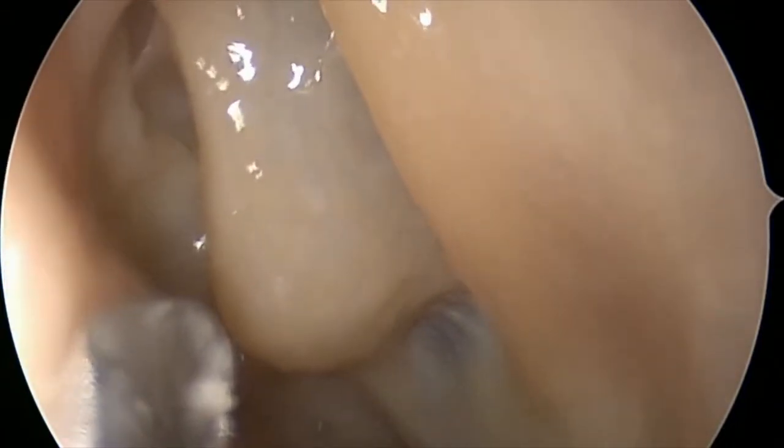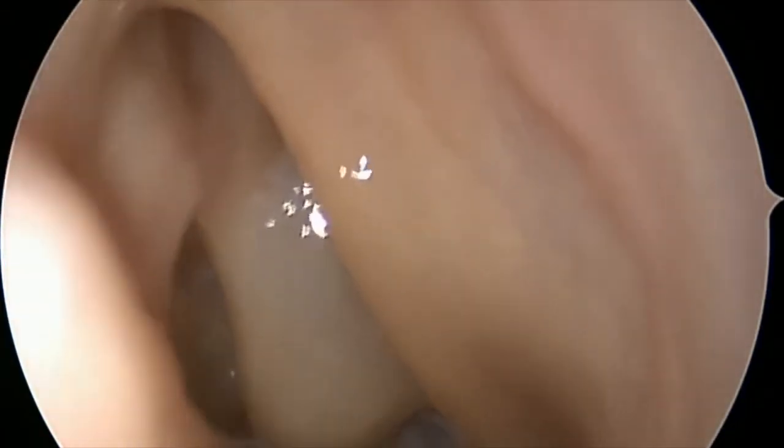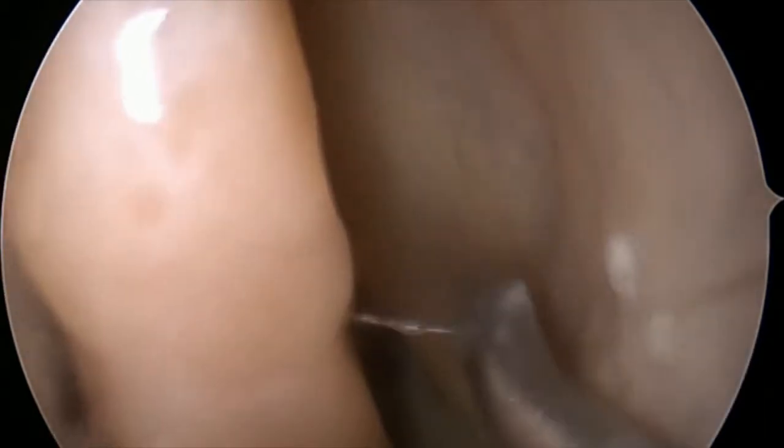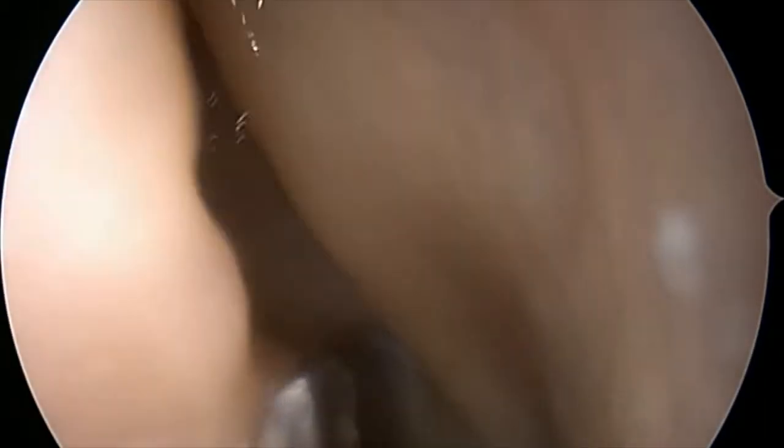We can then look at the inferior turbinate, checking for things such as allergic rhinitis, and then we could look superiorly, look at the middle turbinate and the space below the middle turbinate, referred to as the middle meatus.